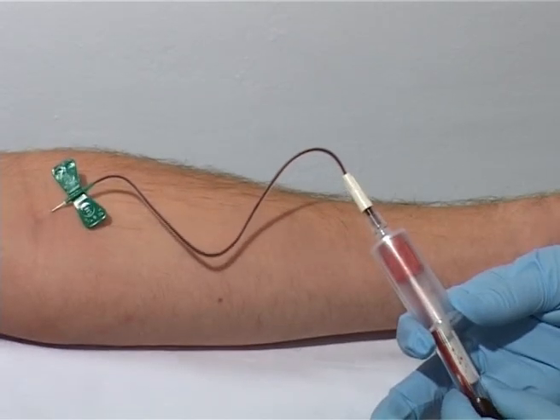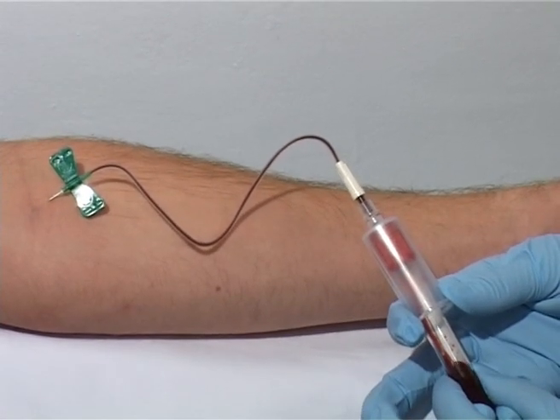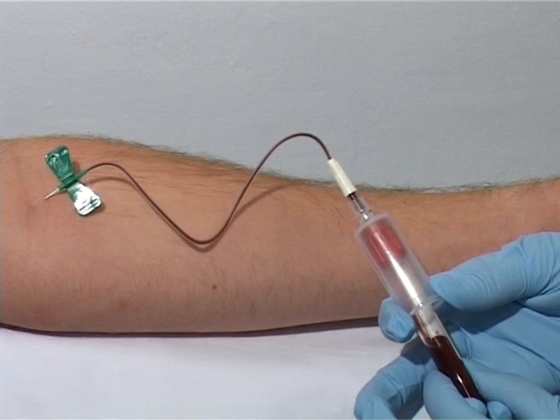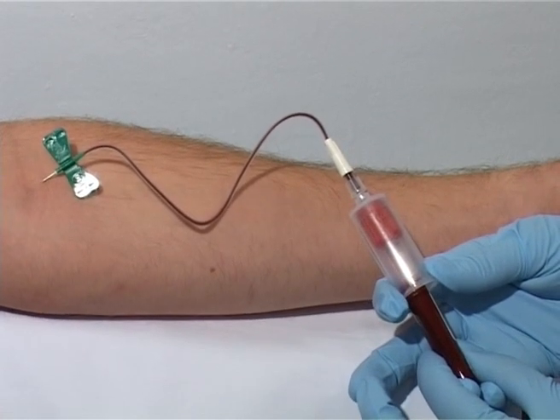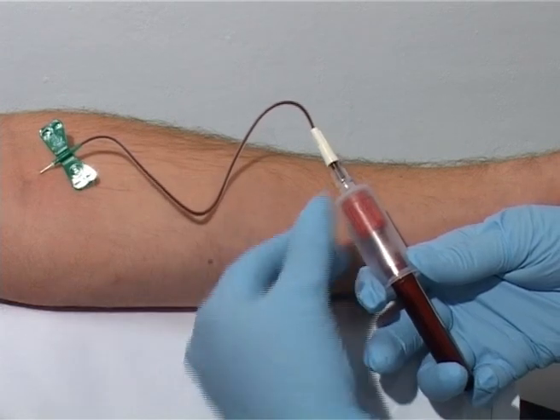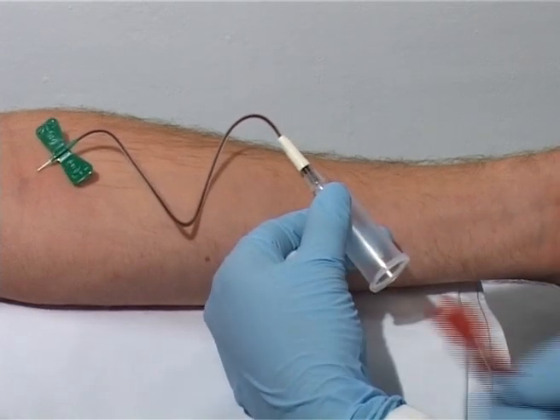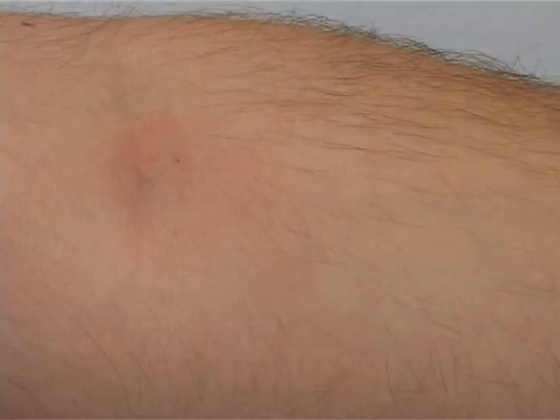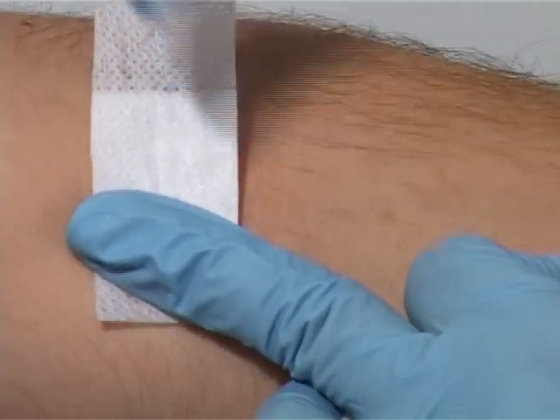The control solution is a 0.9% saline solution, and the positive control is a 0.1 mg per mL histamine solution. Blood should be drawn from the cubital vein. The blood tube must be a serum vial free from all coagulation-inducing substances, and should ideally be made of glass.